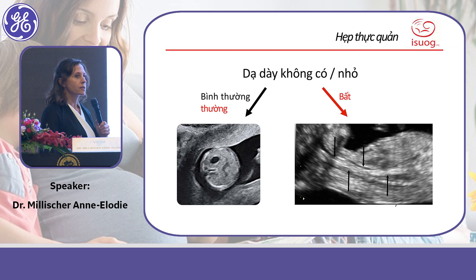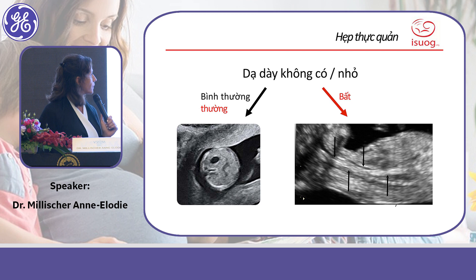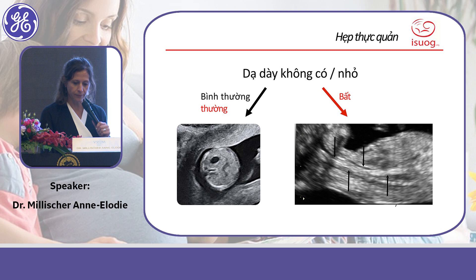When you suspect polyhydramnios with esophageal atresia, check the stomach — you can assess its appearance. Also look for a linear structure just anterior to the spine.